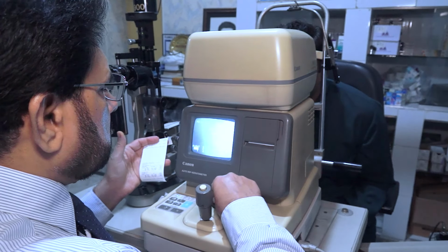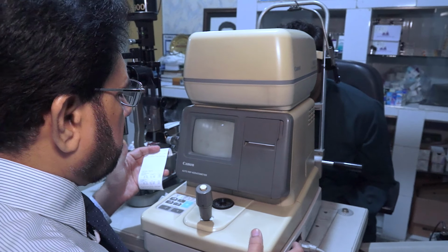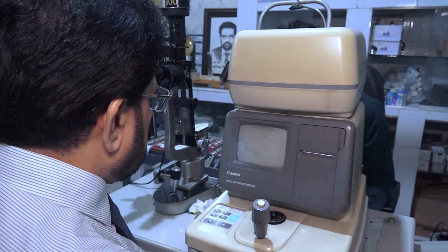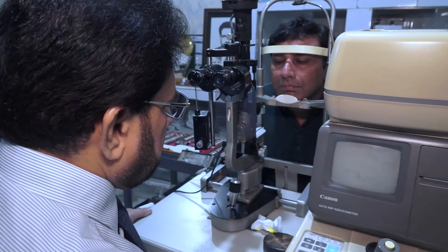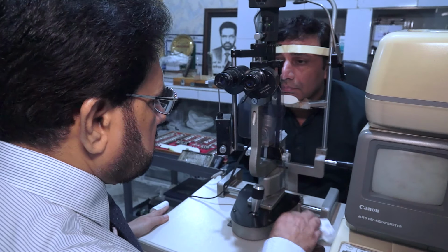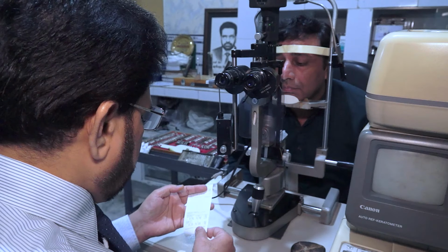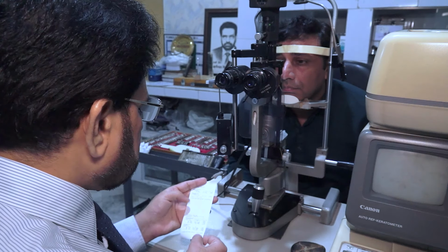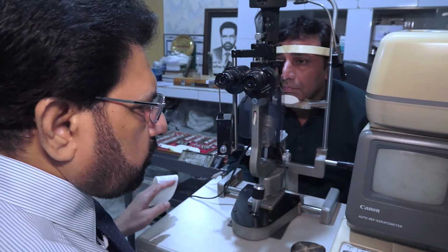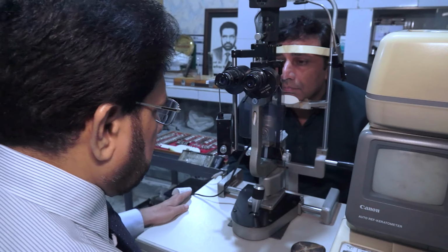The corneal power is used for the calculation of the intraocular lens implants, as well as it helps us to diagnose the astigmatism in different diseases, especially in cases when there is a regular or irregular astigmatism, as in keratoconus. It gives us a reading of the astigmatism as well. So this is how we do an autoref, and then we go for a subjective refraction of the patient.